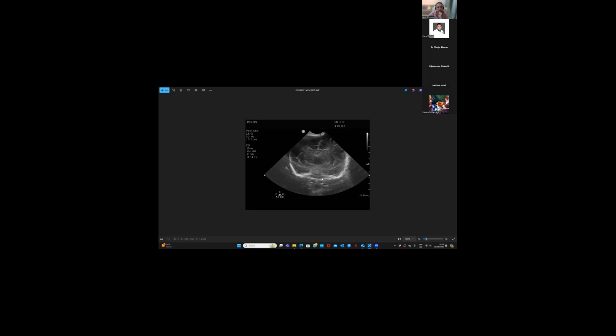So again, it's a beautiful image. My only comment is, can you imagine if that was a little bit bigger? If you had more depth on that, and were filling about 3/4 of the screen, you want to reduce that 10 of depth to about 6 or 7. But the rest of the image looks beautiful.